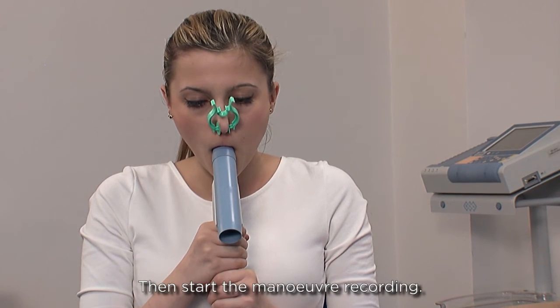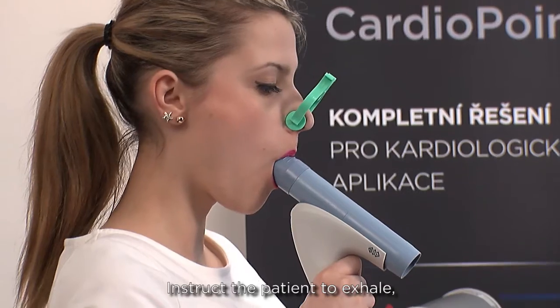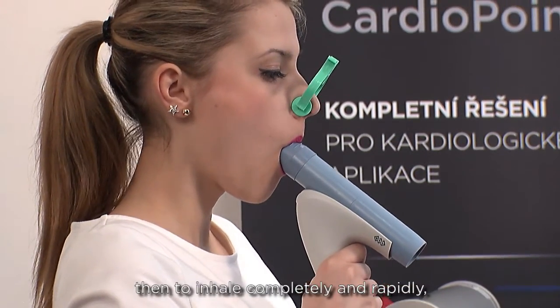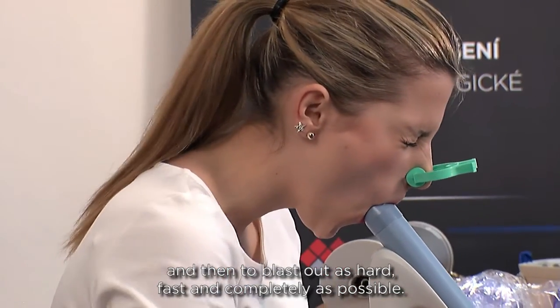Then start the manoeuvre recording. Instruct the patient to exhale, then to inhale completely and rapidly, and then to blast out as hard, fast, and completely as possible.